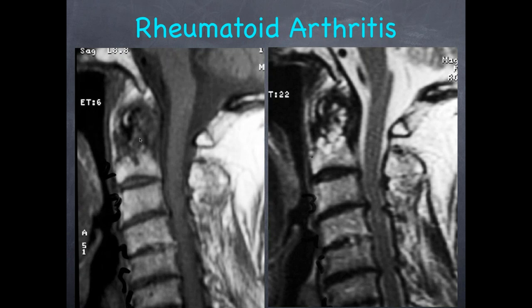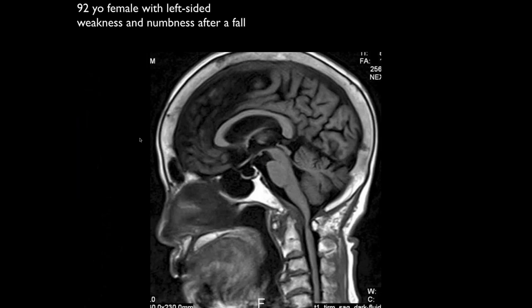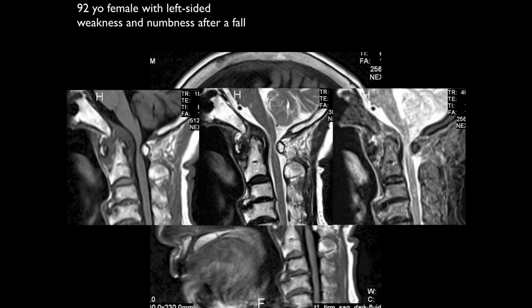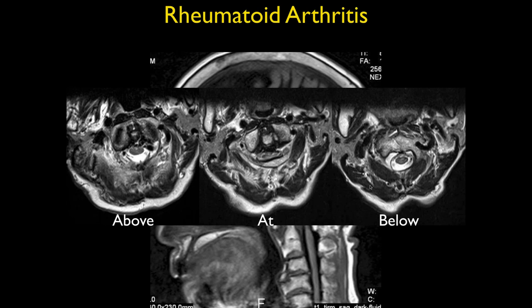Looking at this case: female with left-sided weakness and numbness after a fall. We see pannus formation around the dens process, erosion of the dens with significant mass effect on the cord, and narrowing of the canal. There is also signal in the cord. This is another case of rheumatoid arthritis at C1-C2. Once you see it and know to look for it, it's easy to find — but most cases in clinical practice are initially missed because if you're looking only for disc disease, you tend not to look at that level.